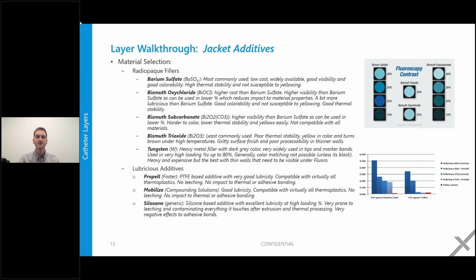The problem with tungsten is you're using it at a really high percentage. It's particulate, it's little particles. The strength of the material falls off, and there have been some issues in the industry where the tips aren't bonded very well to the next material adjacent to it, and they've fallen off because they tend to be a little bit more brittle. So usually it's a good idea to overlap materials with tungsten tips or markers and not just butt weld them.